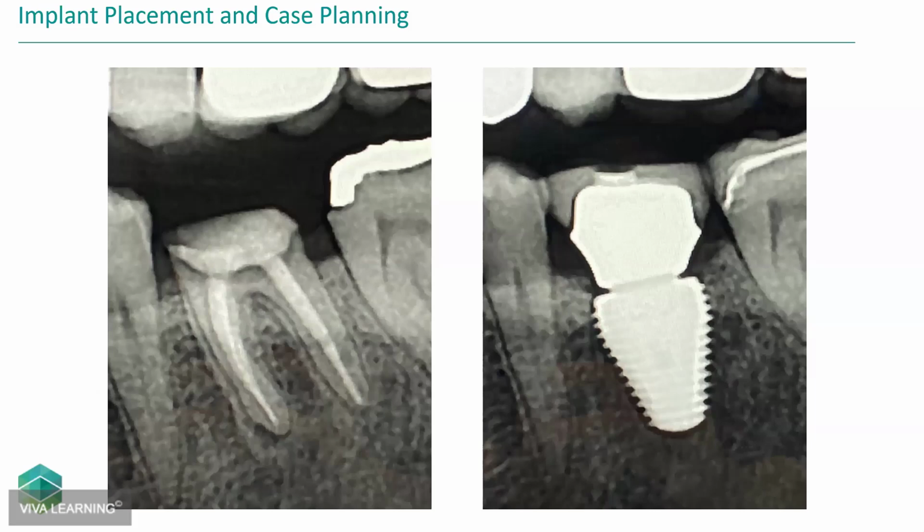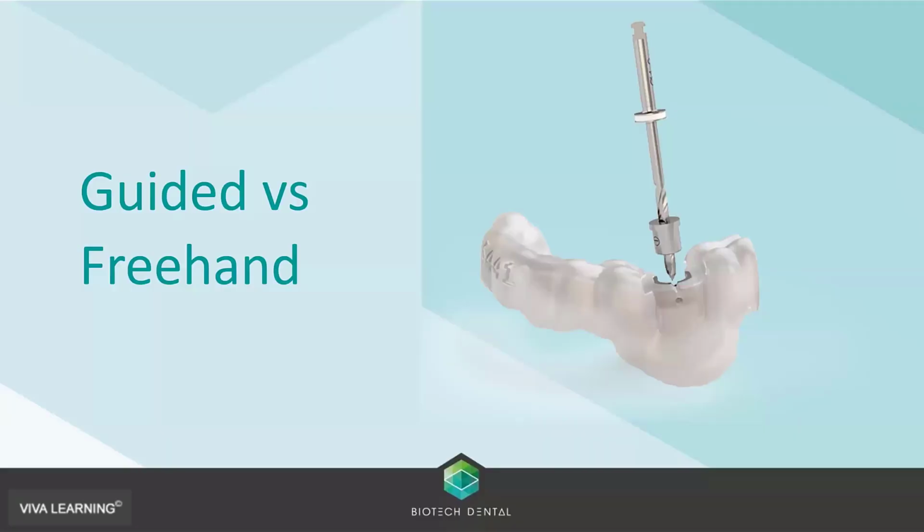Just like your typical case here. It's not super deep. Honestly, right now, looking at this case, knowing that I did this case, I would probably have put that implant a couple millimeters lower.